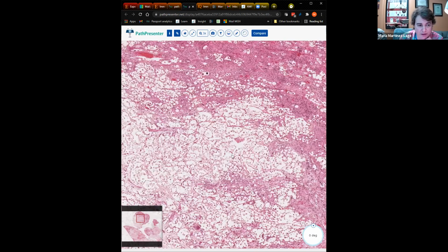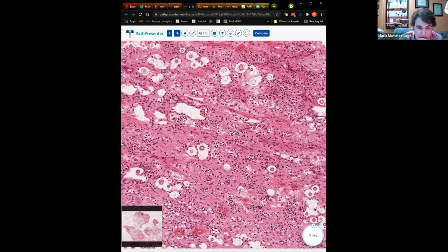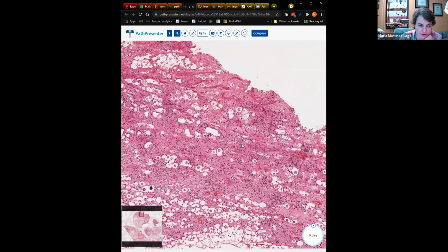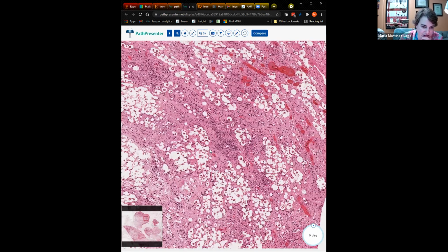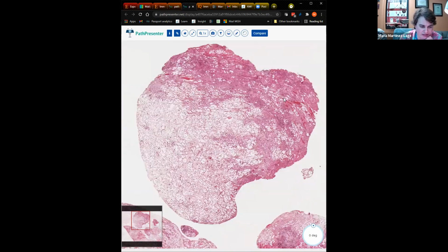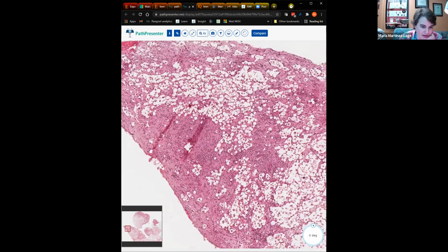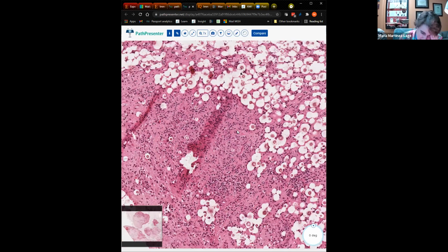They can elicit an inflammatory response, of course, but some of these patients, if they are truly immunocompromised, might have very few circulating lymphocytes. So occasionally it looks, paradoxically, paucicellular in terms of the inflammation response. Here you can see potentially some plasma cells, maybe some lymphocytes responding to the Cryptococcus. The other thing is if you have an autopsy brain with cryptococcal infection, it will feel very slippery. So that's also another clue. All right, so not a lot more to say.